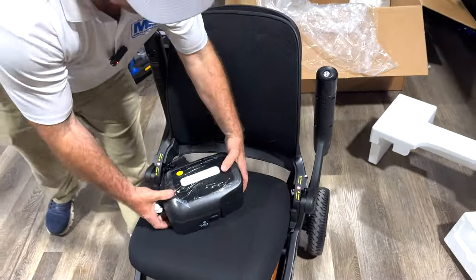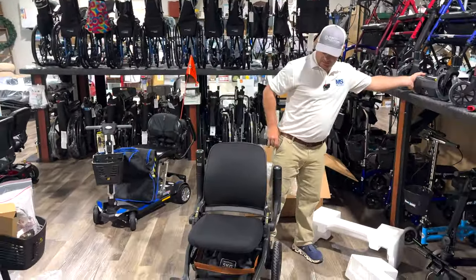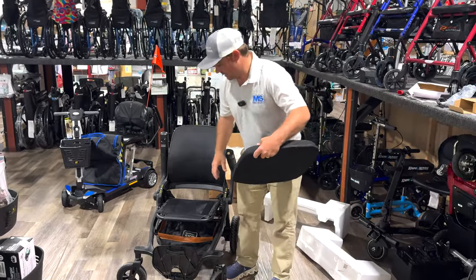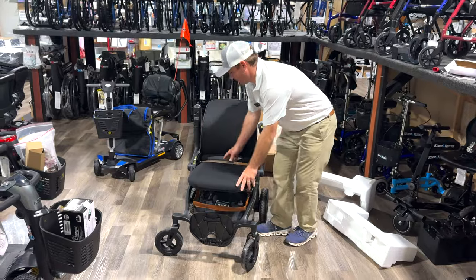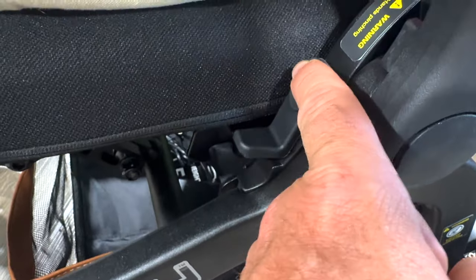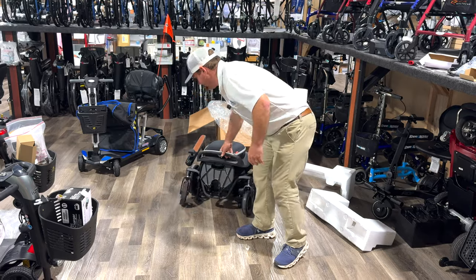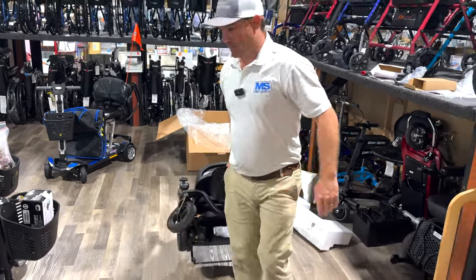And this is probably like 6-7 pounds. Let's fold this up real quick. Oh, look at this, is your memory foam seat cushion. You can change these seat cushions if you like. Here's your nice storage compartment. So fold this down. There's these little levers on one side. You don't have to do it on both. So one side, bring it here. It's gonna scare you a little bit. Folds down. Then you can actually roll this like this.